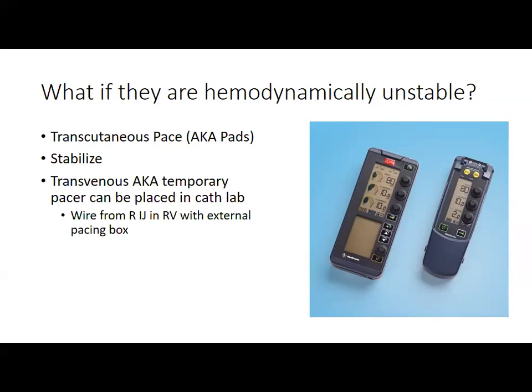It's pretty nice to be able to do that for people. You would not want to transcutaneously pace someone for any significant period of time. Let's say this happens when you're on nights at 10 o'clock and you're like, oh crap, they just had sinus arrest, or they just went into some sort of bradyarrhythmia where I needed to pace them, whether that's complete heart block, sinus arrest, whatever. Transcutaneously pace them to make their heart beat, but you would not leave them on that all night until the team comes in the morning to do a permanent pacemaker. You would get that temporary wire in overnight.